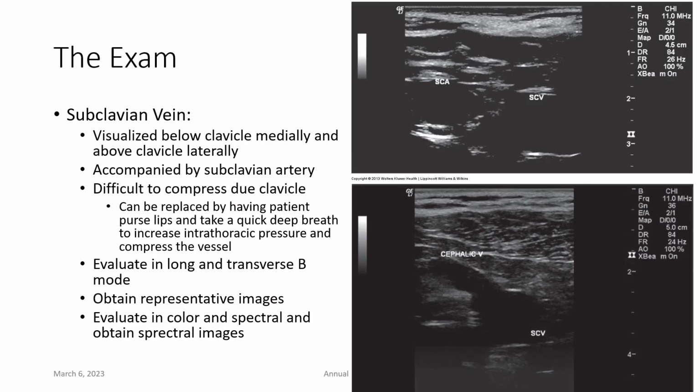So with your subclavian vein, we know that anything beyond where that jugular combined with it to make the brachiocephalic, anything lateral to that would then be your subclavian vein. It's accompanied by the subclavian artery, and it gets a little bit more superficial than that brachiocephalic.